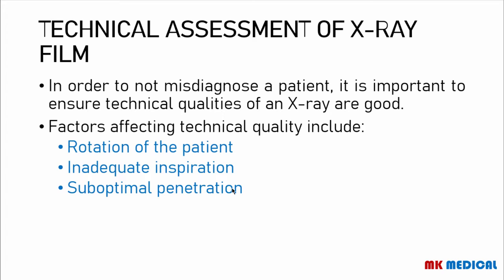Then the next thing that you're going to be assessing is, of course, the technical quality of this X-ray. Because if this X-ray is not taken well, if it doesn't have good quality, you may misdiagnose certain important things. So there are three factors that we're going to be assessing when we're looking at the technical quality. The first is rotation of the patient. The second is whether the X-ray is taken on adequate inspiration or inadequate inspiration. The third is whether there is inadequate or suboptimal penetration.